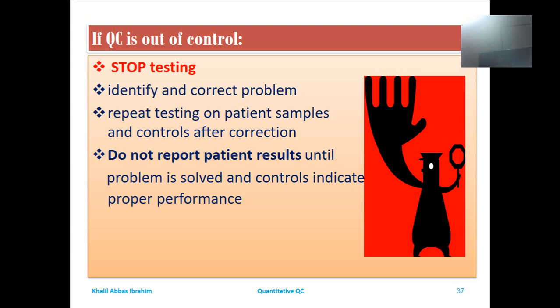Do not report patient results until problems are solved, because this action is of no use. It is of no use to use a defective system that is still experiencing problems, unless you resolve the problem and assure that your system has become effective and without errors. Never use it.